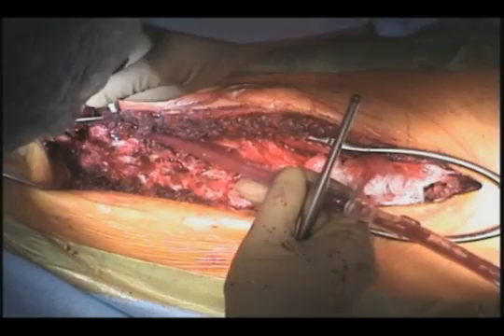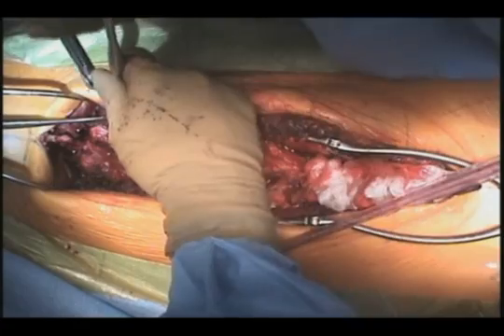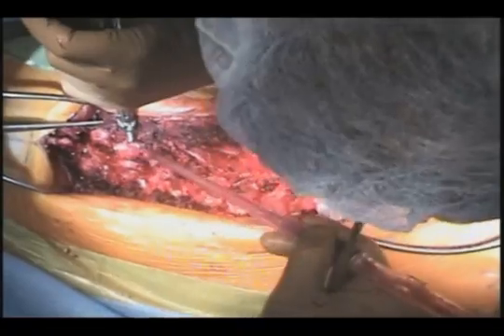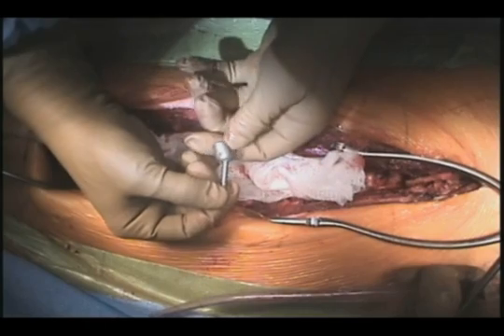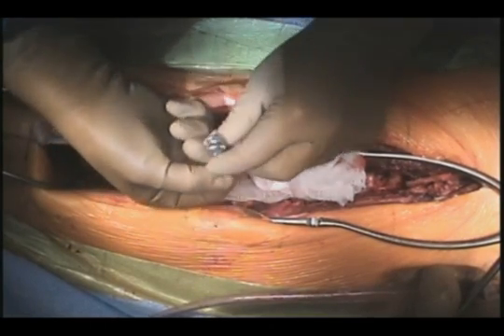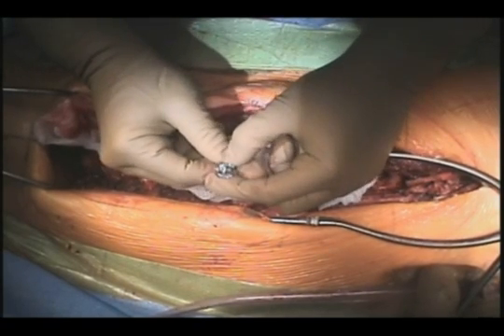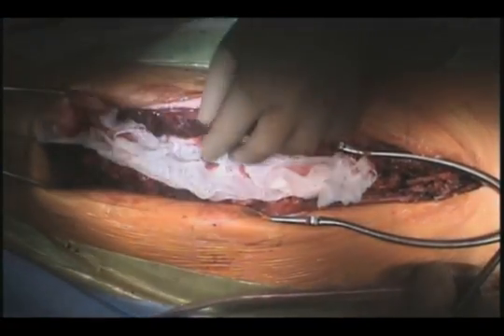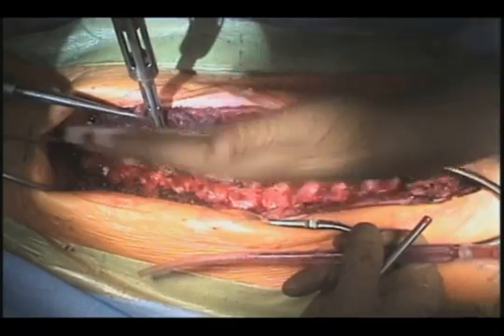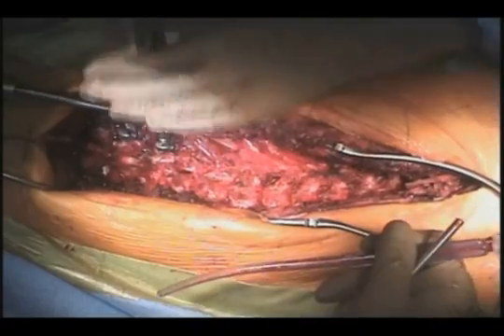We then introduce a palpating probe to ensure intact bony margins at the caudal, medial, cephalad, and lateral borders of the pedicle, as well as an intact floor. And doing this in combination with the drill allows us to have safe placement. This is a uniplanar screw, so it is mobile only in the cephalad-caudad direction, which allows for some variability of placement of the screw, but is fixed in the medial-lateral direction, allowing for a derotation maneuver to be performed with maximal efficiency.